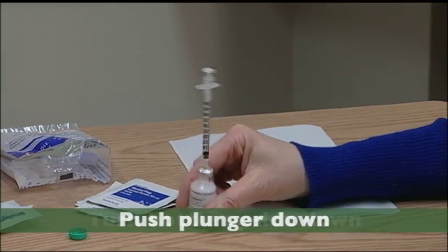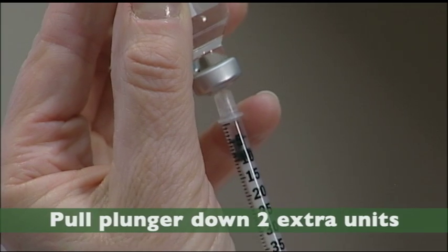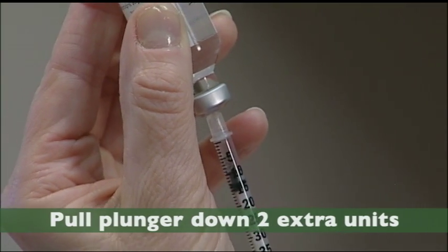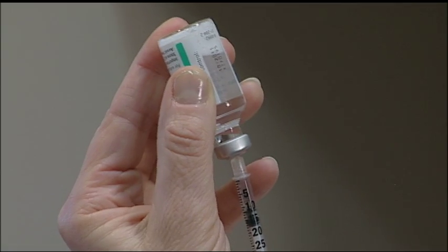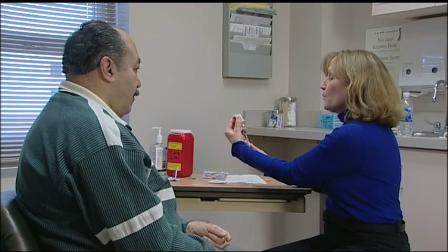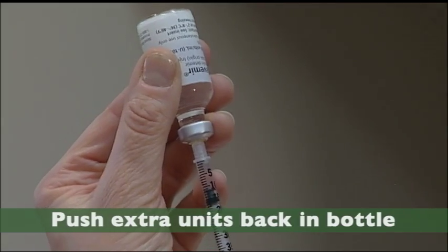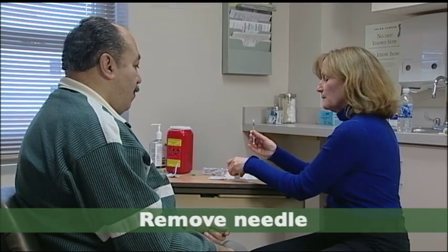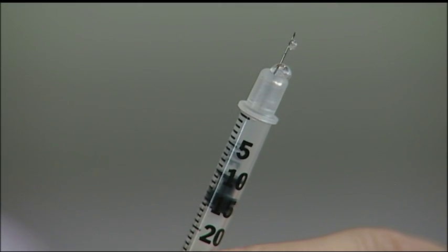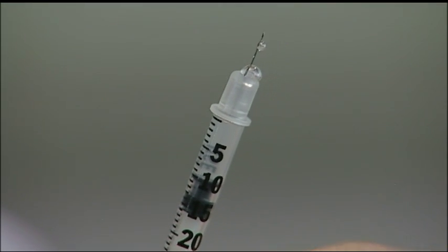The next step is to turn the bottle upside down and slowly pull the plunger down two additional units beyond the dose you'll be injecting. Since you'll be injecting 10 units, you'll pull the plunger down to 12. We do this to push the two extra units back up into the bottle to make sure there's no air. Remove the needle, and always double-check your dose to confirm you'll be injecting the amount your doctor has prescribed.